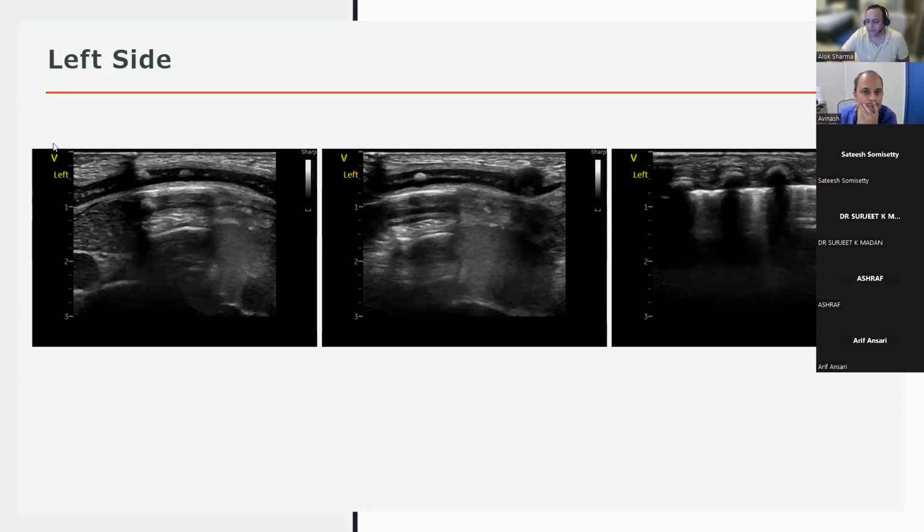Look, I just wanted to ask, can you show us again the air bronchogram, how can I locate them on ultrasound? I'll show it to you, because I'm going to do RDS on Sunday. We will have a lot of really nice images. Oh yeah, definitely.